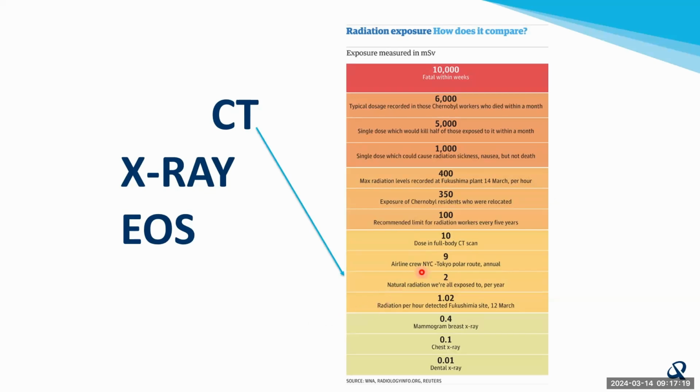So a single region CT is not so much as a full body CT, down around the 2 to 3 range. Interestingly, if we're talking about spine imaging, X-rays are not far behind CT. If you do a lumbar spine X-ray, particularly AP, lateral, obliques, and flexion extension, you're heading towards the dose of a low dose CT.